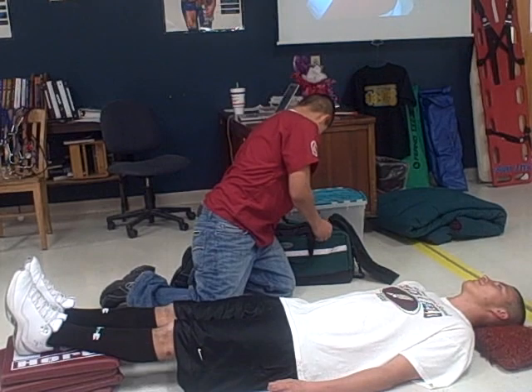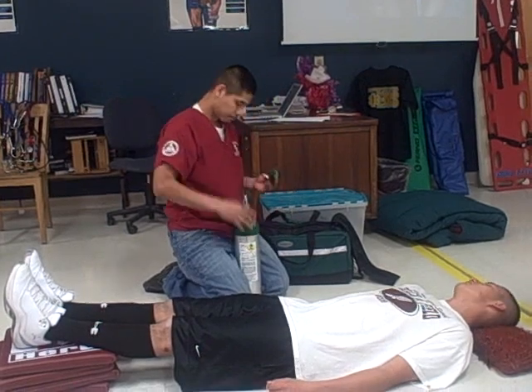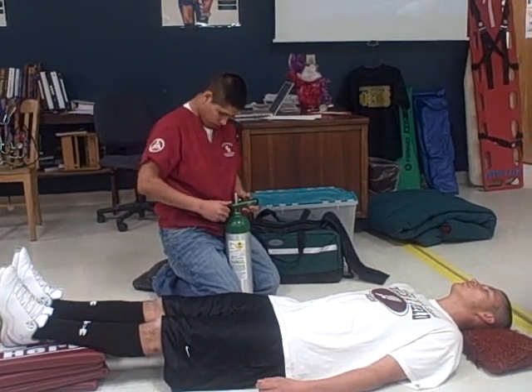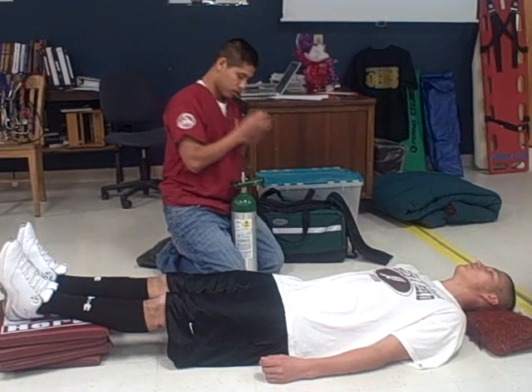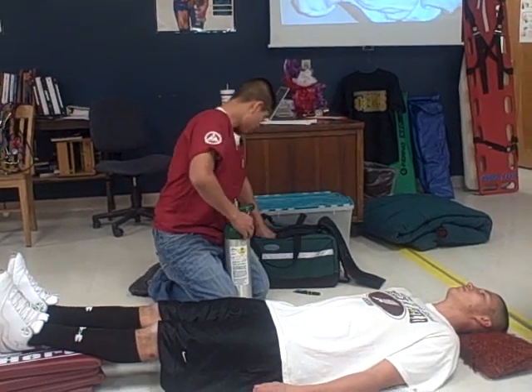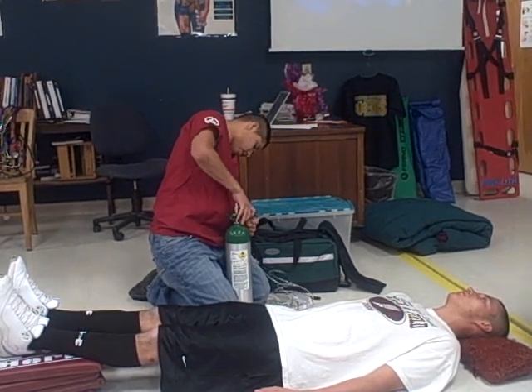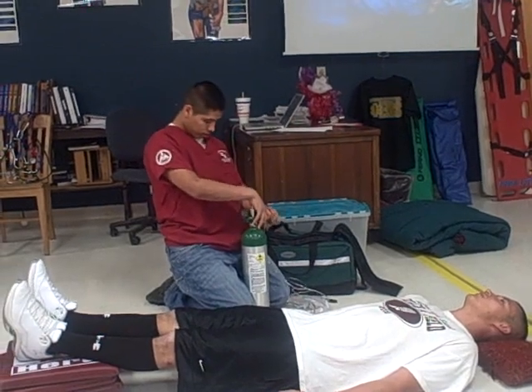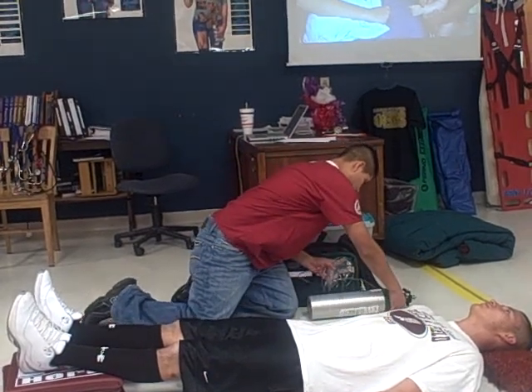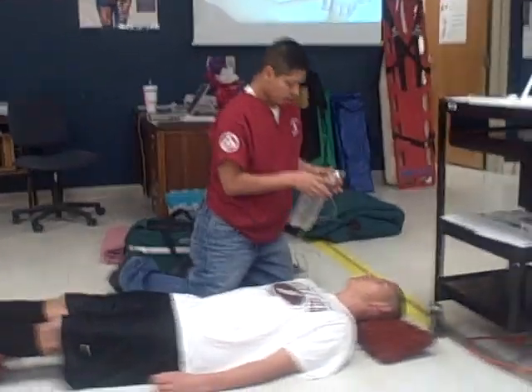And I will apply oxygen to my patient using a non-rebreather face mask. Now I will open the tank and check for leaks — there is pressure. Now I will connect the non-rebreather face mask and adjust it to 15 liters per minute. And I will fill the reservoir and apply it to my patient.